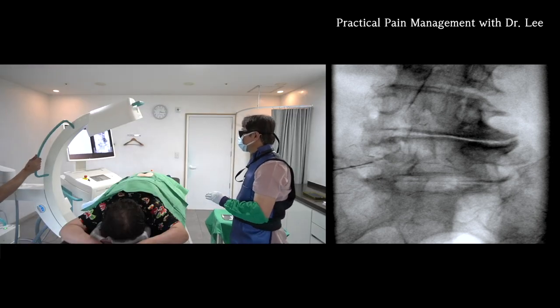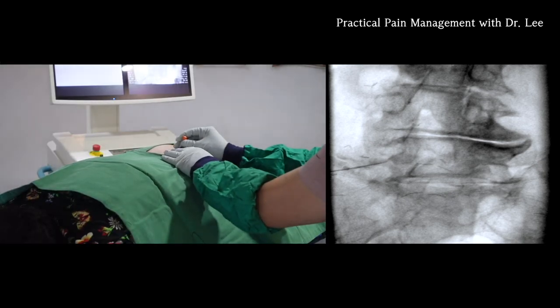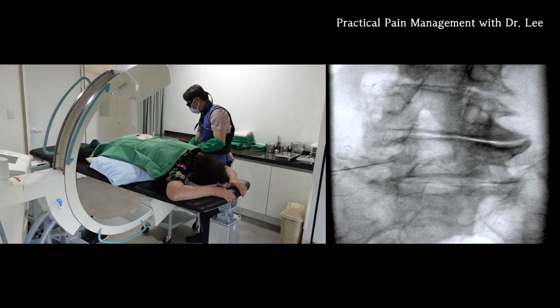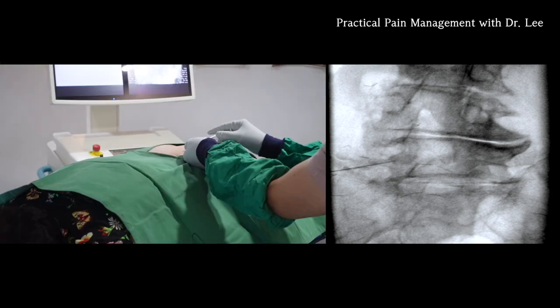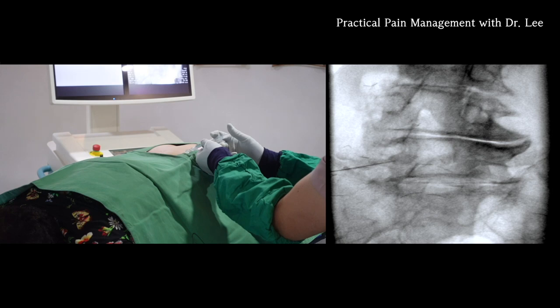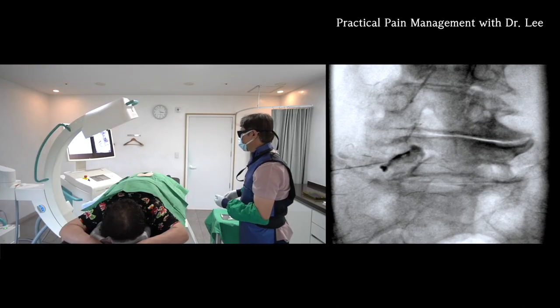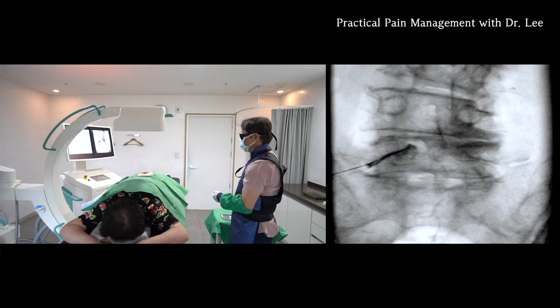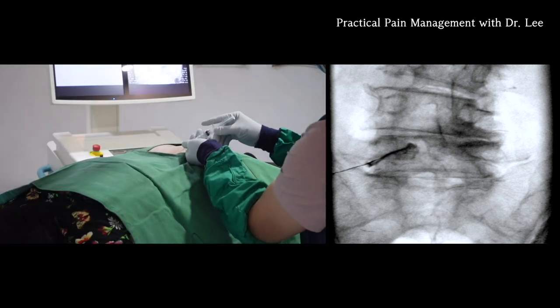Give me a contralateral oblique view. The contrast spread looks good to me. I'll deliver the steroid mixture.